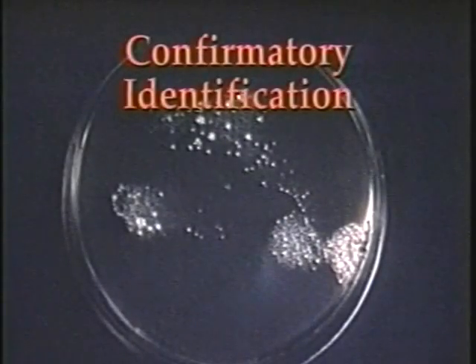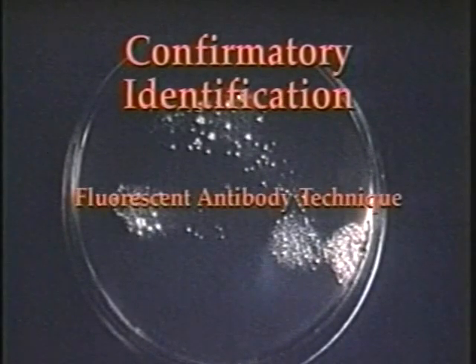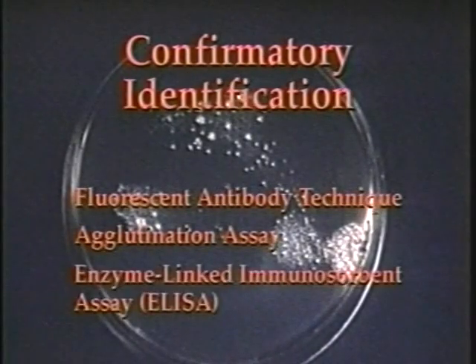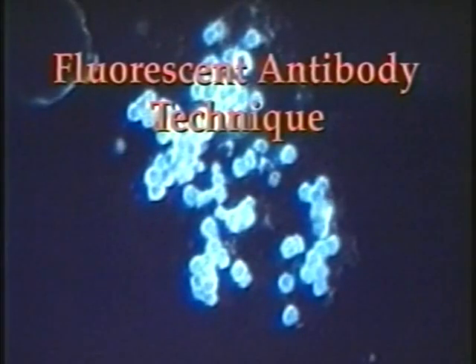Confirmatory identification of most bacterial fish pathogens is based on serological tests. These tests include the fluorescent antibody technique, agglutination assays, and the enzyme-linked immunosorbent assay, or ELISA. Each of these techniques uses antibody prepared against the pathogen of interest. The fluorescent antibody test, or FAT, can be used to identify bacteria from smears of tissues and fluids, or from histological sections, as well as from culture.